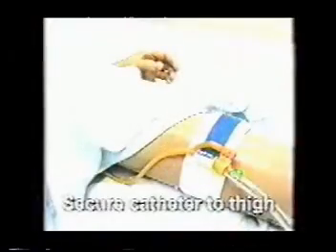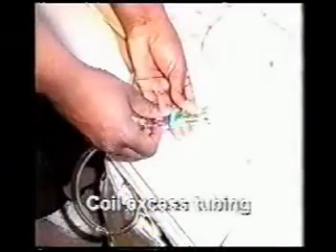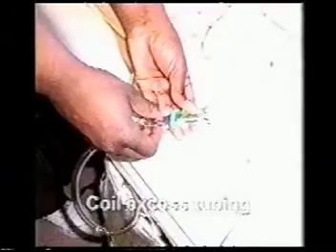Catheter leg straps should be used to prevent pulling on the bladder. Note that the catheter leg strap may not be used if the patient has a circulation problem, and also if their skin has irritation from the leg strap, it would not be used. Make sure the tubing is free from kinks and that the urine is flowing freely by coiling excess tubing and attaching the tubing to the bed linen with a plastic clip.